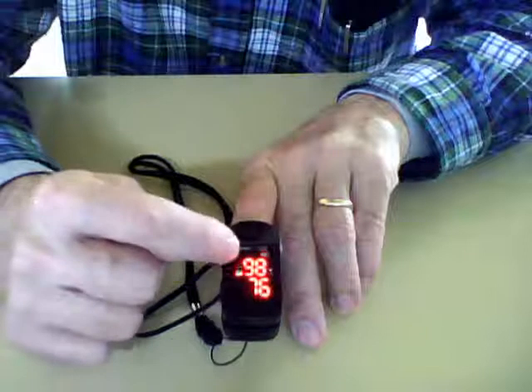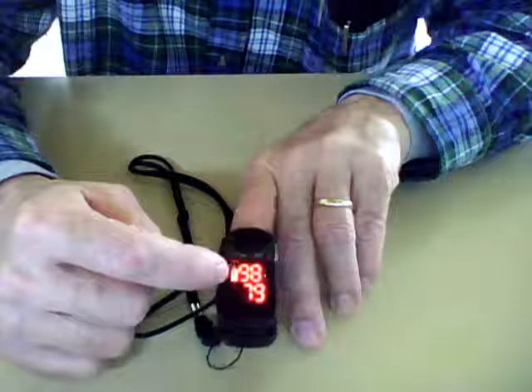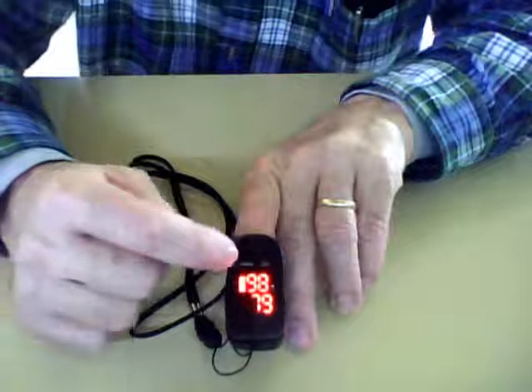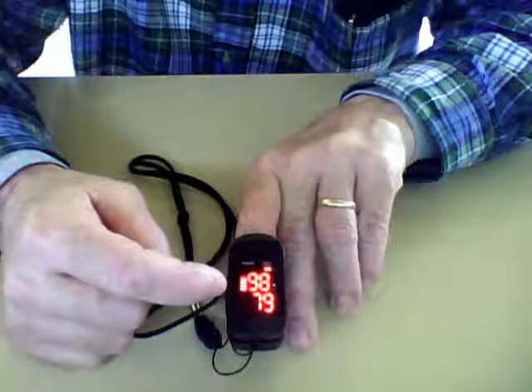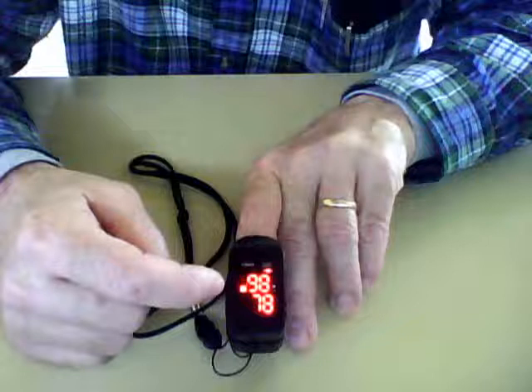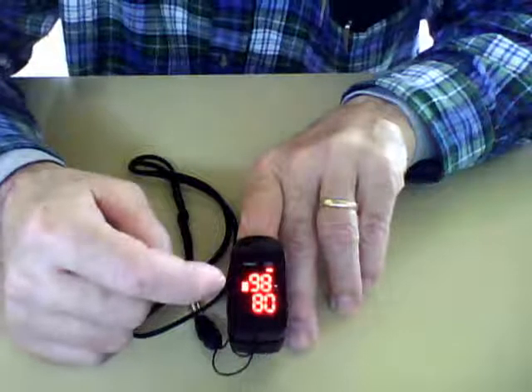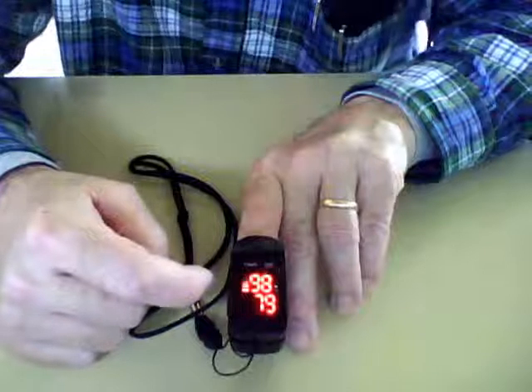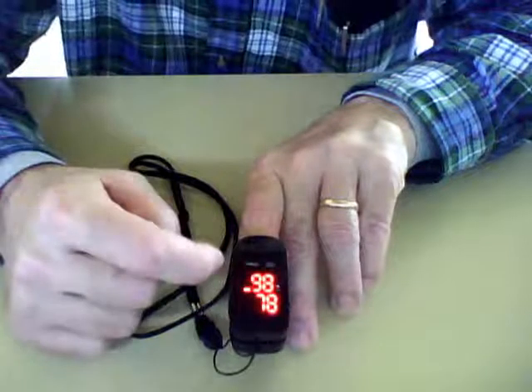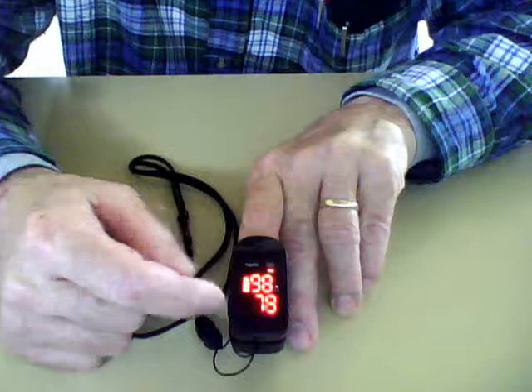it just gives you a good indication of your oxygen level, which is really important for people with periodic paralysis, because that's one of the things they will really benefit from, is oxygen supply, especially when these oxygen levels drop below 90. So that's something you really need to check out, getting some oxygen. If you see readings below 95 on this, I would get with your doctor on that.